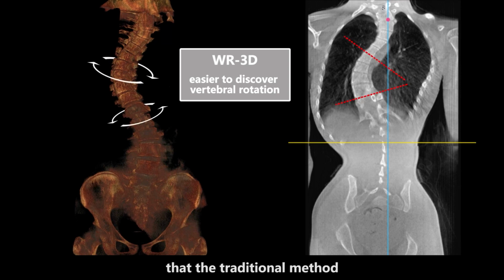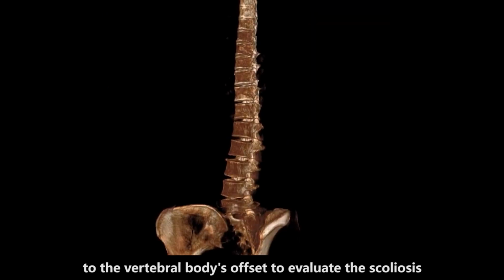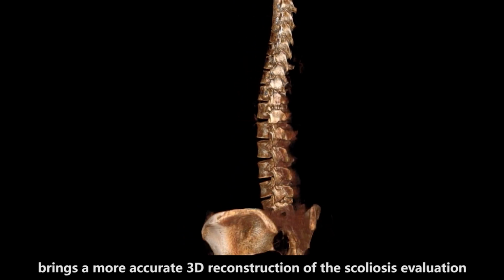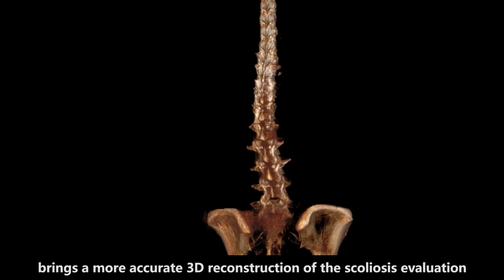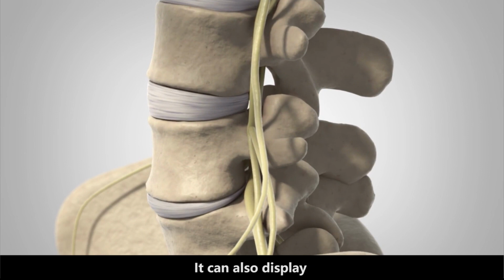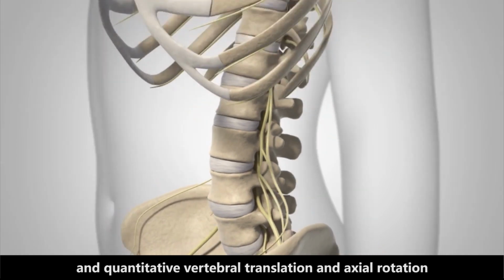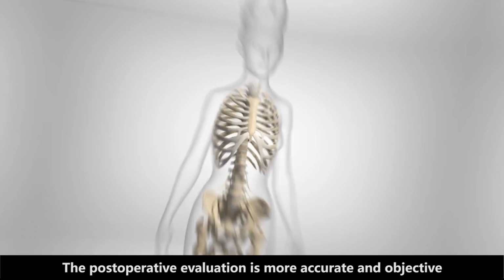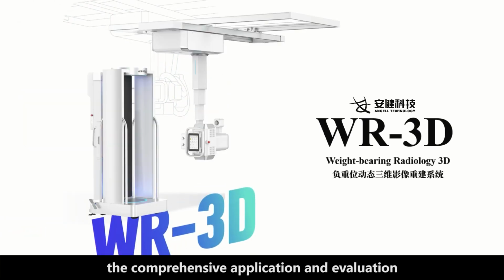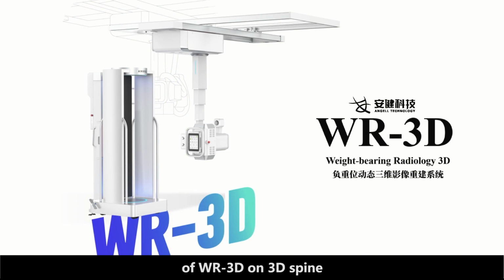We can see that the traditional method is based on the two-dimensional plane, relying on the spinous process or vertebral protrusion relative to the vertebral body's offset to evaluate scoliosis. However, WR-3D brings a more accurate 3D reconstruction for scoliosis evaluation, which is conducive to the formulation of surgical solutions. It can also display and quantify vertebral translation and axial rotation. The postoperative evaluation is more accurate and objective. Therefore, the comprehensive application and evaluation of WR-3D on the 3D spine has very important practical value.